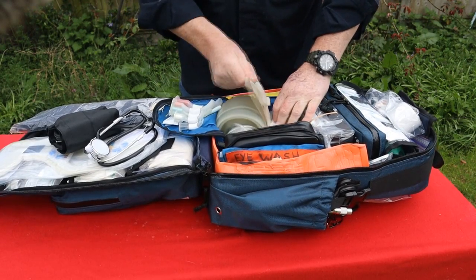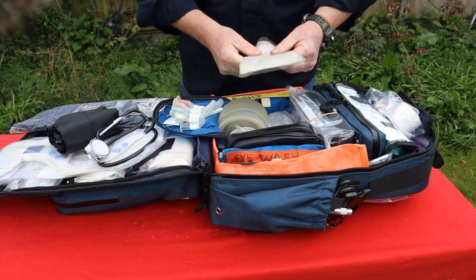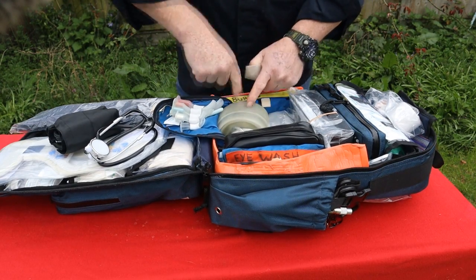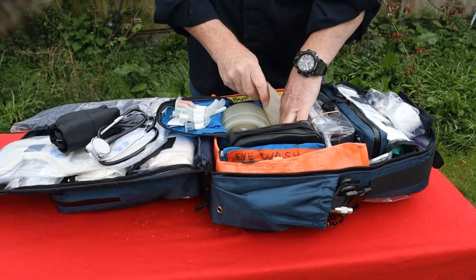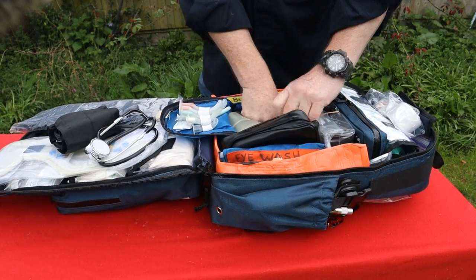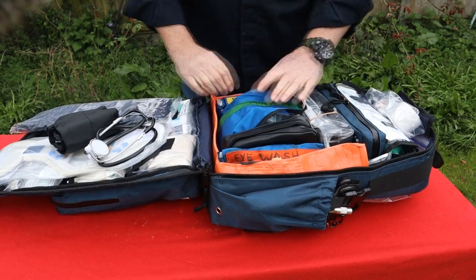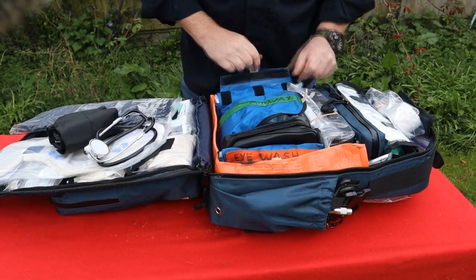management bag, and I've got a 100% rebreathing reservoir, so if there is oxygen, this fills up with 100% oxygen, gets plugged into the bag. That's what we're giving the patient, and in the short term, or if a patient's being resuscitated, 100% oxygen is a good thing. It's as good as it gets. That's my airway bag.